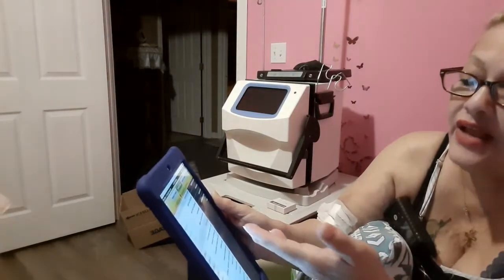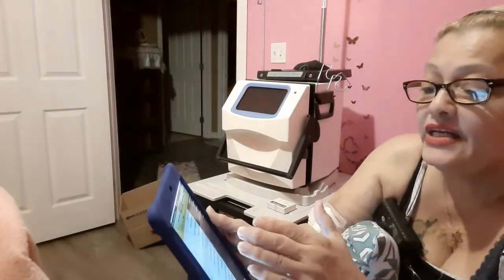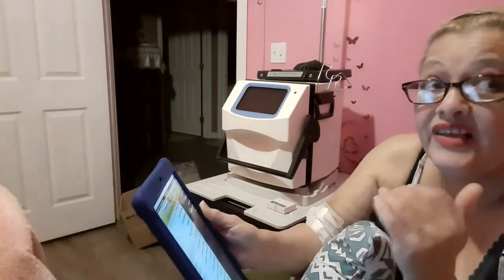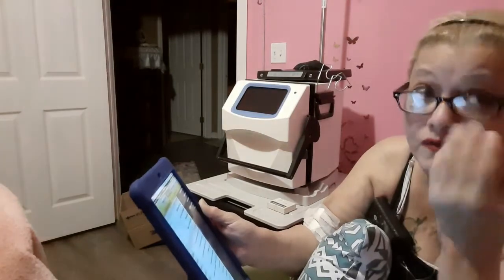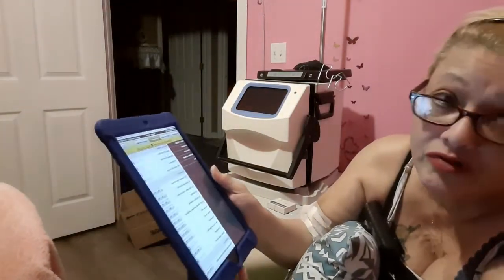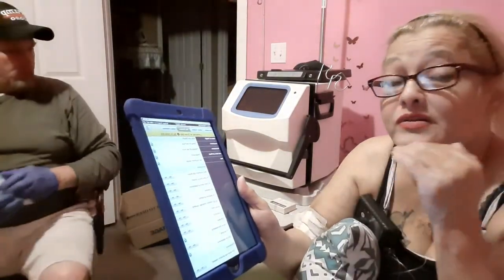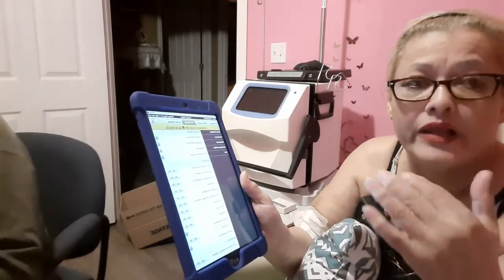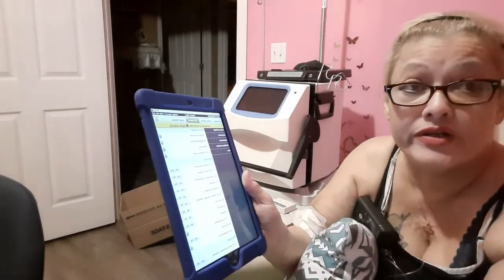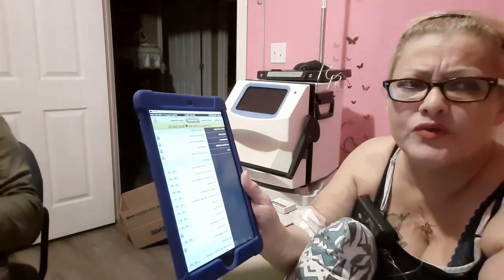But anyway, it also asks if you had labs drawn, if you have any shortness of breath, any chest pains or palpitations, any swelling. All these assessment questions are very important, because if you have any of those things, like shortness of breath, palpitations, chest pain, that's something you really want to alert your team about, because dialysis could be pretty rough on the heart, which is why home hemodialysis is key to getting the slowest process of filtering out the waste, whatever the body doesn't need, that's really hurting other organs. That process could be a little harsh on the heart, because the heart's like, well, wait a minute, the kidney's supposed to be doing this, what's going on here?